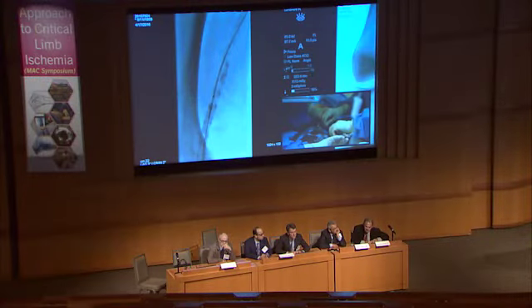Yeah, the other thing we found useful is if you have some areas that are compressed like this, in the post-dilation protocol, go with a short, not a long balloon, and that allows the stent to reformat itself. If you go with a really long balloon, it tends to pin it, and it does not allow the stent any movement. So right now, Mehdi, it's saying we have no time left. I'm not sure, because we started a little late. Yeah, I think we have a few minutes.